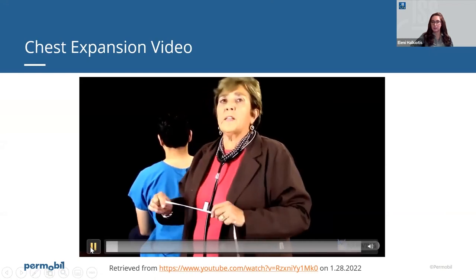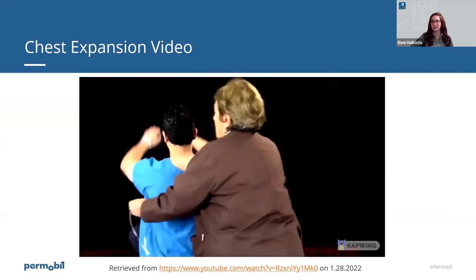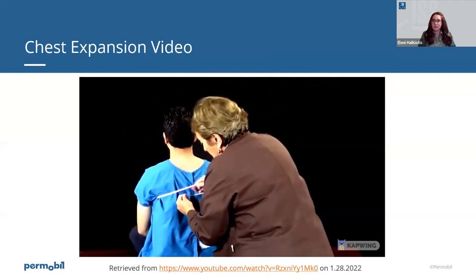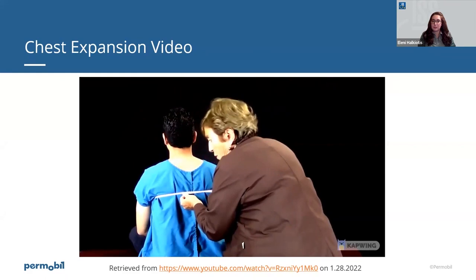I'm going to play a video where a woman demonstrates how to measure chest expansion in an able-bodied male. And you're going to be placing this under the axilla on top of the pec muscles on a male. So if you put your hands up, please. Okay, put your arms down. You want them to relax. You want to pull it very, very tight and get an idea of where it's going to move with about a half a centimeter as he breathes in and out.